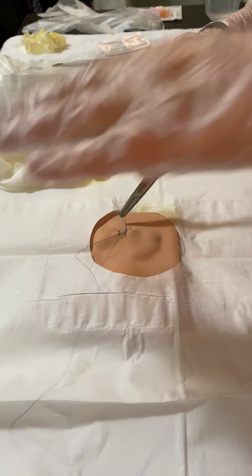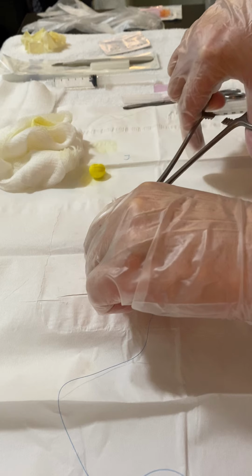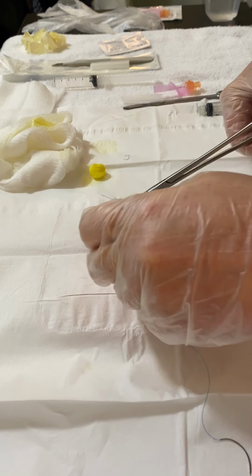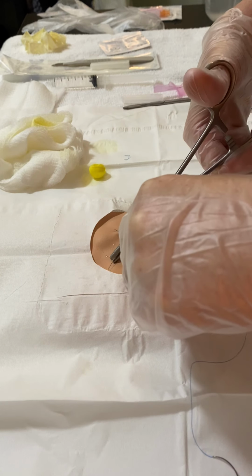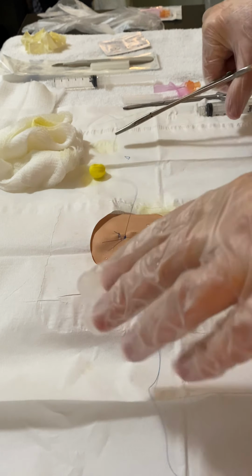Again, a couple more bites here. Pulling tight. And one more to secure.